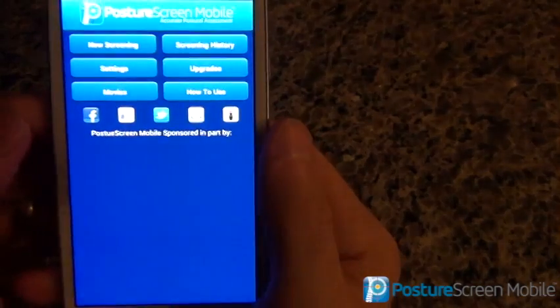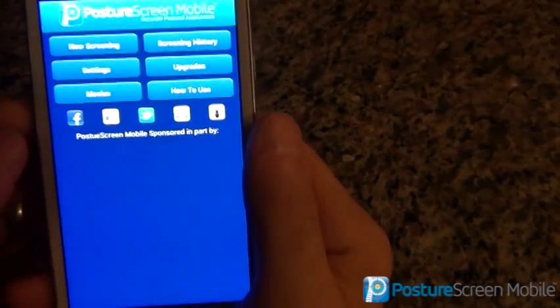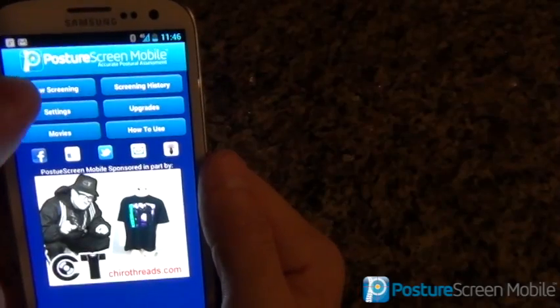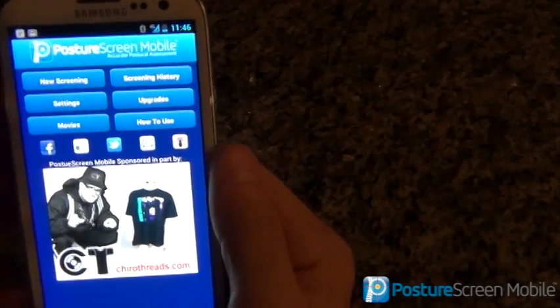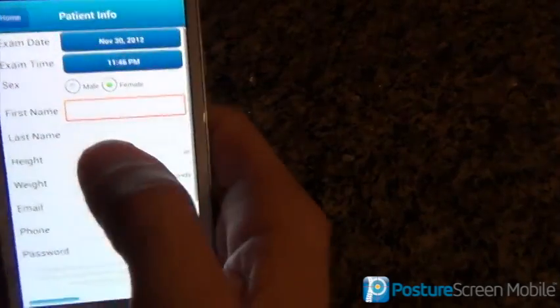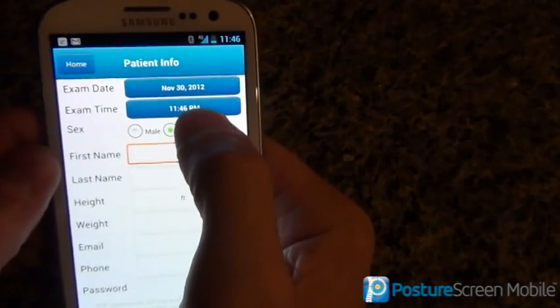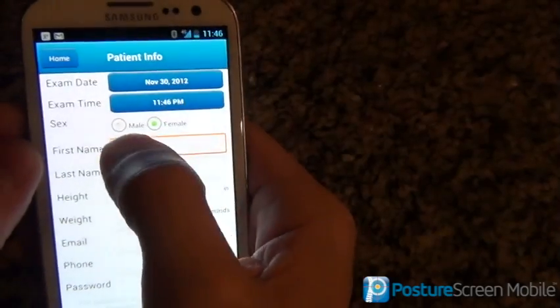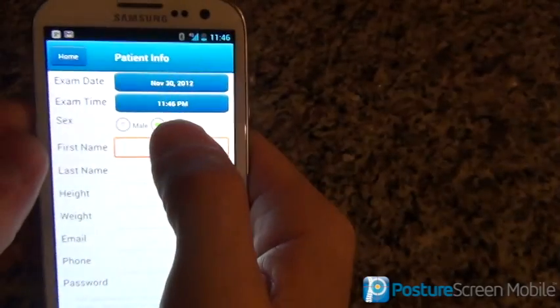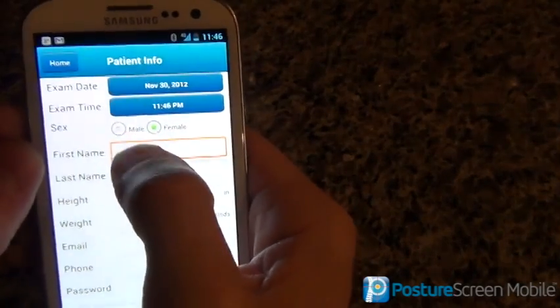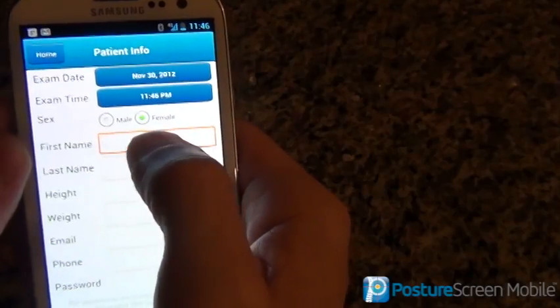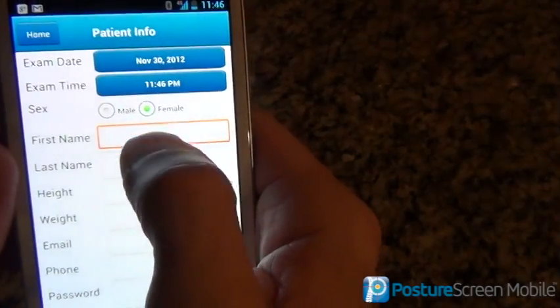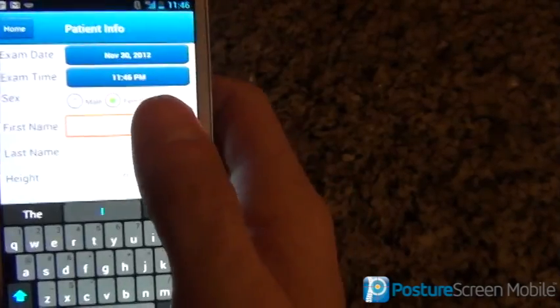Now what we're going to do is our first screening. I'm going to put their name. We can go ahead and change the date of the exam if we'd like — it's going to default to the current date and time. We'll say that she's a female.